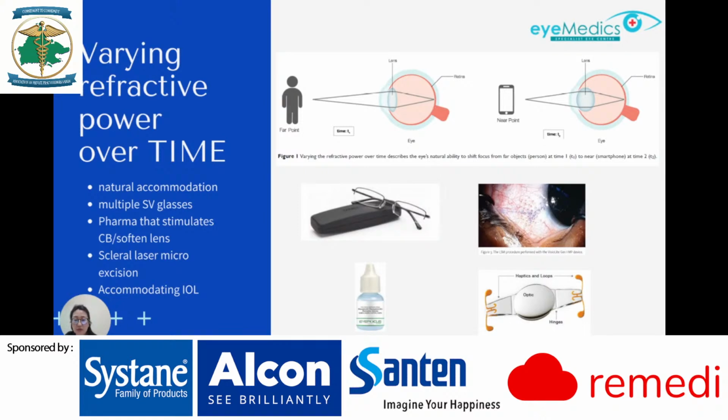With no current FDA-approved presbyopia treatment in this category, it is not possible to assess the safety and also the efficacy. The sole intraocular lens so far to receive approval from the FDA is the accommodating intraocular lens, the Bausch & Lomb Crystalens intraocular lens. However, this lens has its drawbacks, as it demonstrates limited objective accommodative response movement on aberrometry.